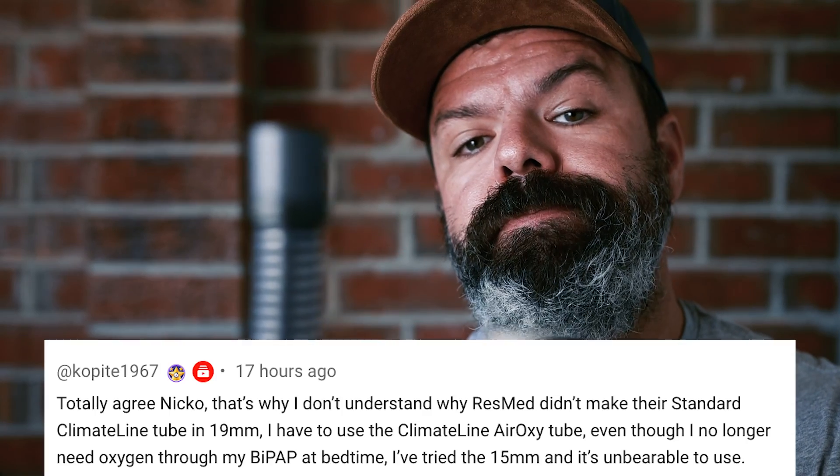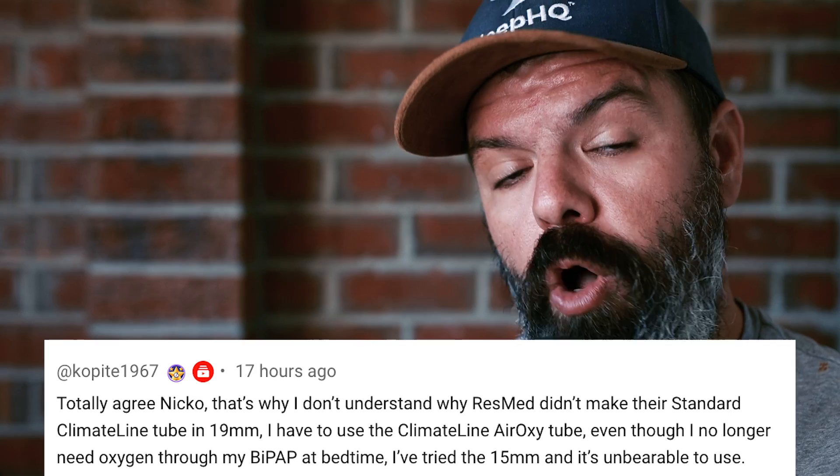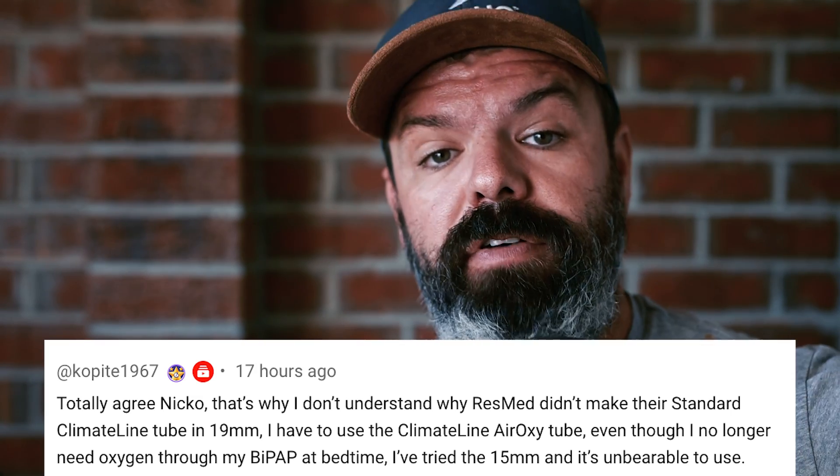Switching to this larger diameter makes breathing more natural, more comfortable, and can really help solve a lot of those issues caused by the fast air velocity.